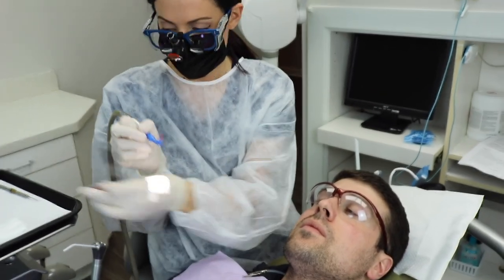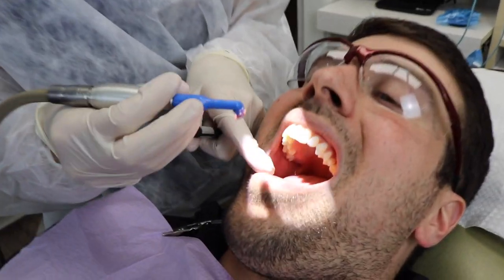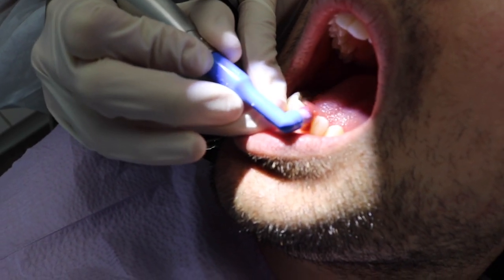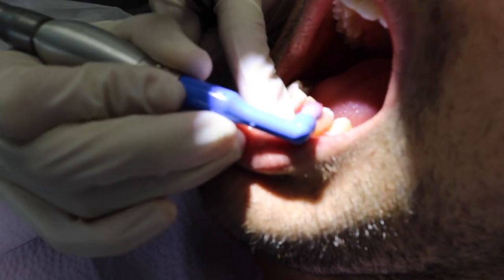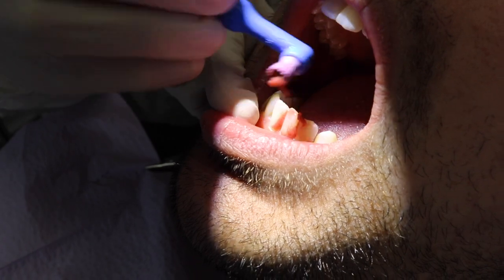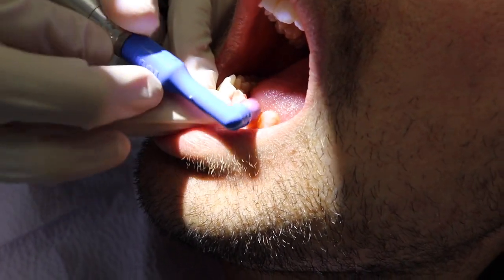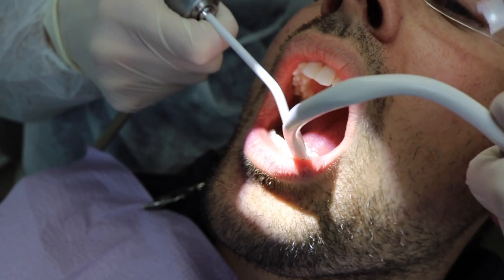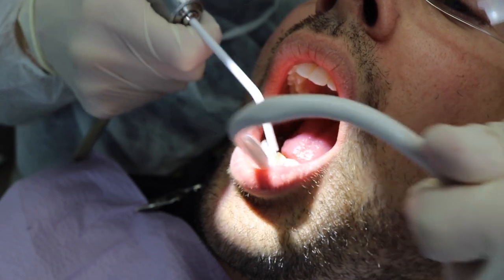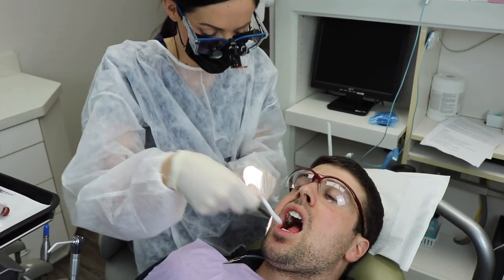My other tip: if you accidentally put on way too much — like that's way too much, it's gonna fly everywhere — sometimes it happens. So I still try to wipe it like this, but you know how it gets on the side? What do you do? I've learned something fun: you can actually put it right on the incisal edge and go like that, and look — it comes off and then you can re-scoop it. Try not to put yourself in that position, but if you do — one, two, three — then you're able to manage it.